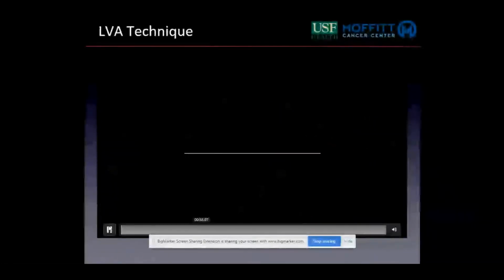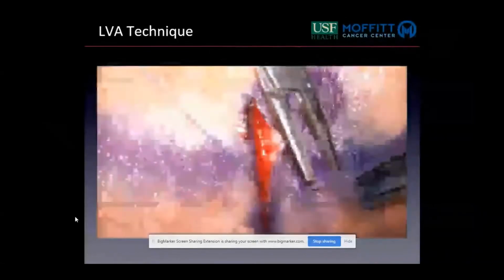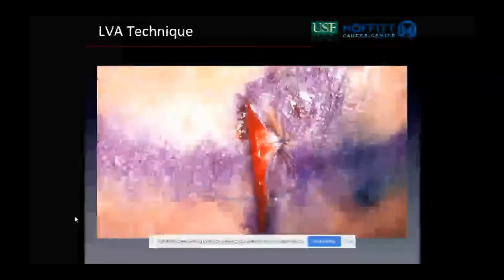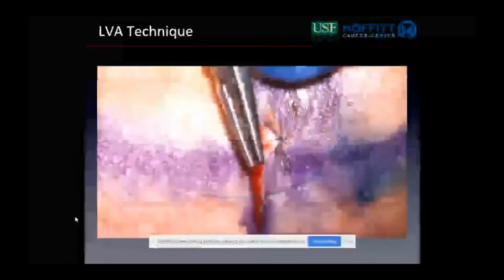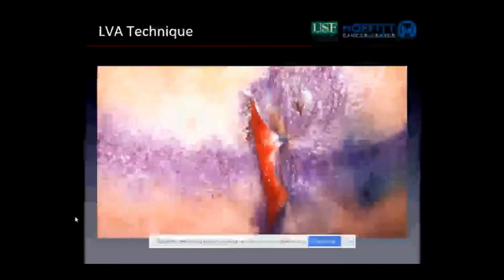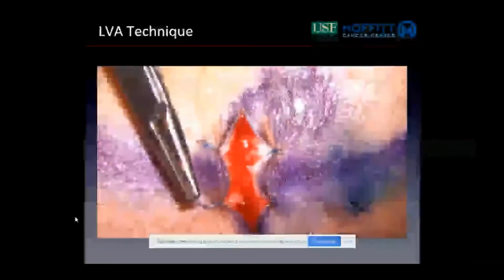And so moving on, I just want to show a quick video of what this looks like when we're performing this. This is a lymphovenous bypass procedure on a patient with stage 1 lymphedema. First of all, I should say, initially we inject the incision with approximately a cc of 1% lidocaine with epinephrine to assist with hemostasis in the dissection.